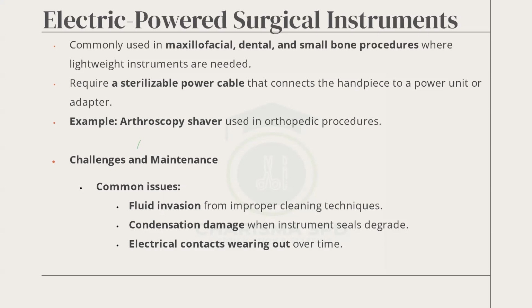It requires, oh no, sorry, a sterilizable power cable. Yes, we have to sterilize the power cable because it is going to come into contact with the sterile field. So it has to be sterilized to make sure that it is devoid of any viruses or any contaminant. That's why we sterilize the cable that the electric power passes through.